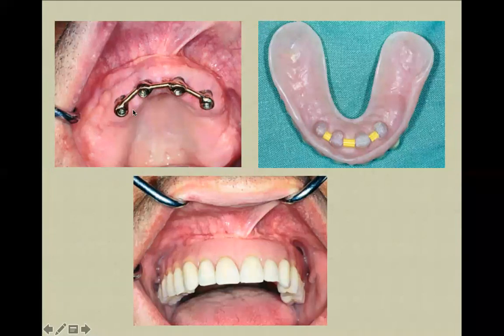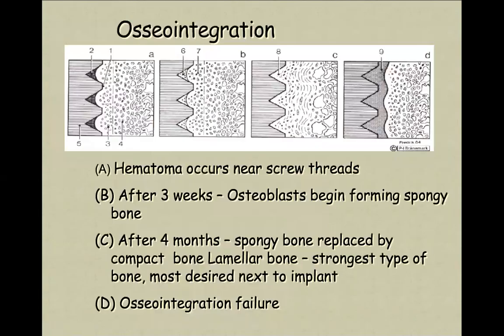And for this particular case, that will be discussed, I think, in the lessons of prosthodontic dentistry, because again, that's not my deal. I'm a pure surgeon, but I'm, let me say, familiar with this system. This is the Dolder bar system, which is a partially removable prosthesis that is supported on dental implants. As you can see, the palatal aspect of this prosthesis does not exist. So it's more comfortable for the patients, more stable, and with that kind of prosthesis, patients are usually happy.